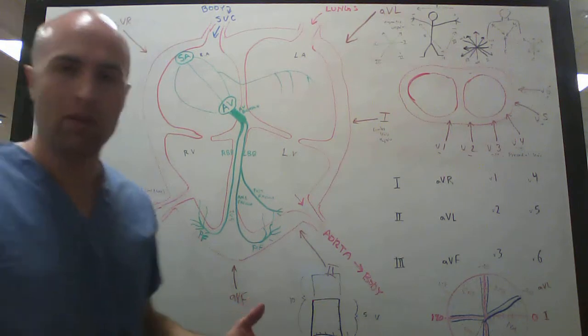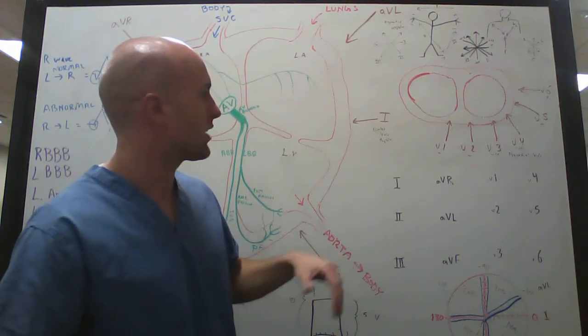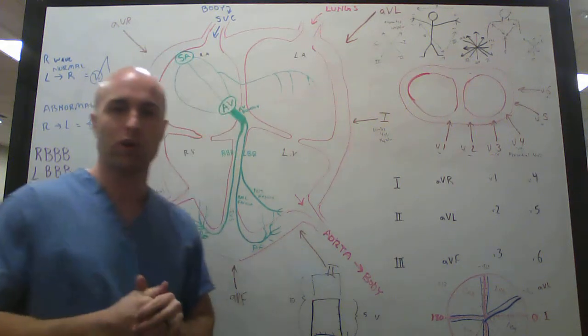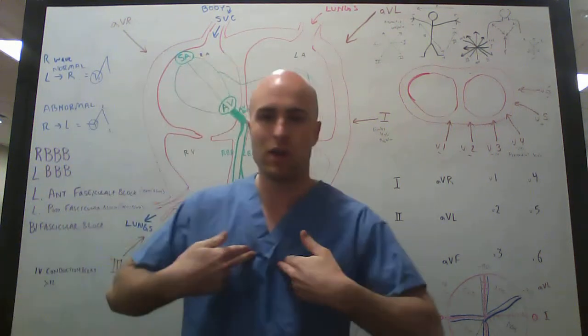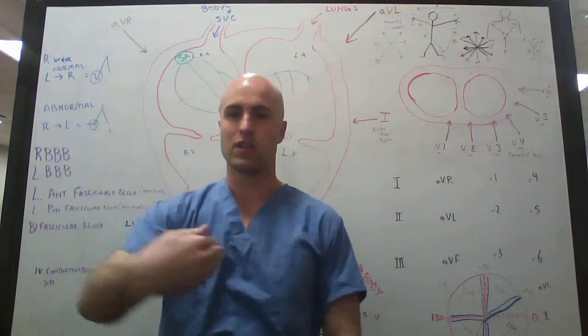Okay, there's one other way of measuring the heart in the 12-lead system, and this is going to be the precordial leads. For the precordial leads, we have a bunch of different angles that we're taking. And instead of coming down like this, all these directions like out here, this is actually coming inward.